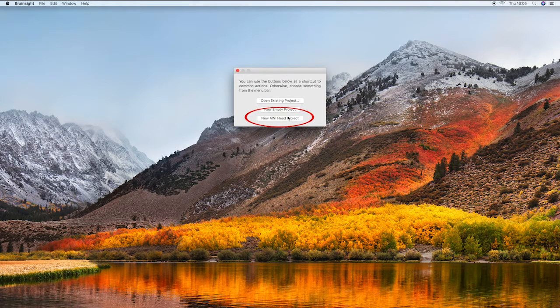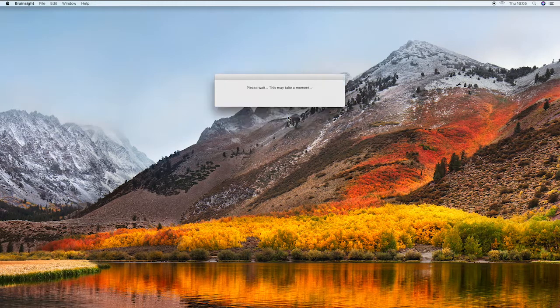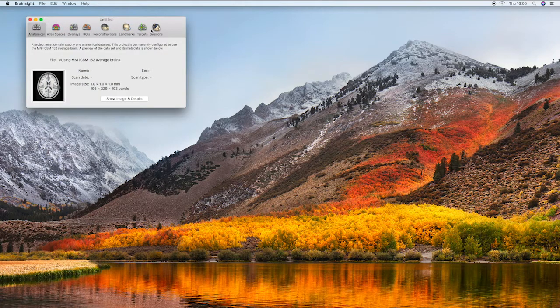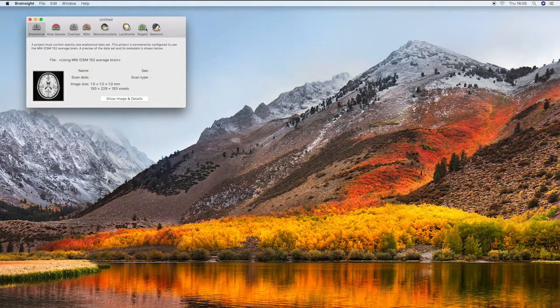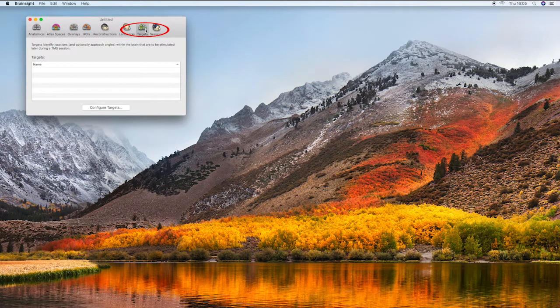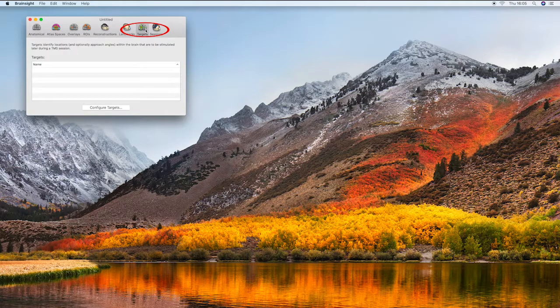Click new MNI head project. Once the project has been opened select targets from the row of icons at the top of the window and then click configure targets.